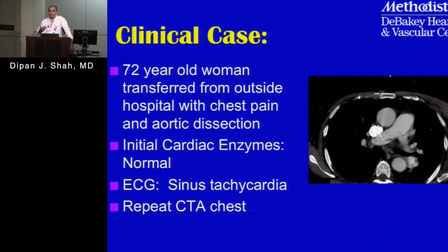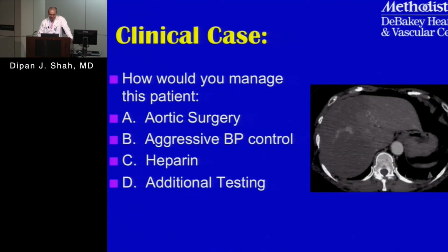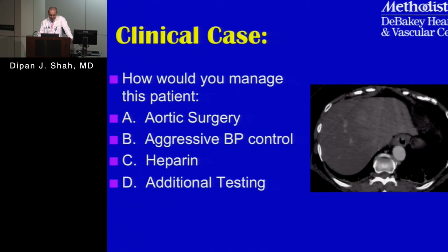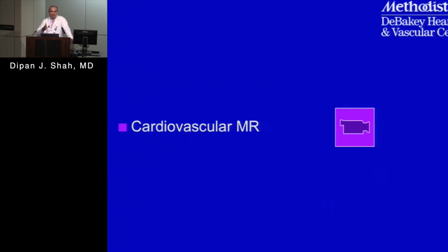So obviously, there's a reason why I'm up here talking. What was done in this case was they got an MRI, okay? And again, the issue is, your question is you've got two different things going on, which raises a concern. On top of that, there was one other thing going on, which is that the cardiac enzyme started coming back elevated as well, right?